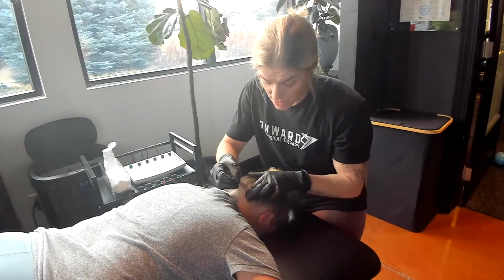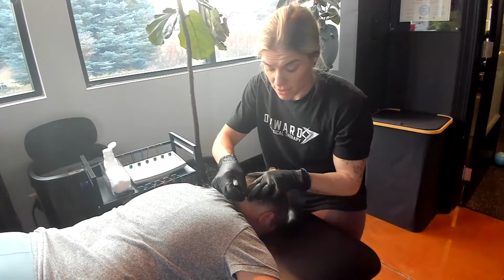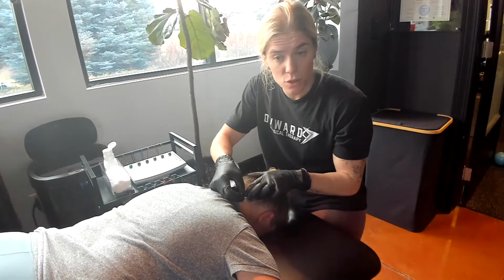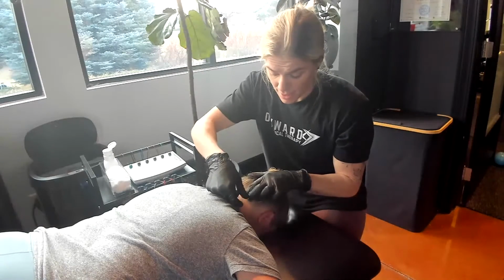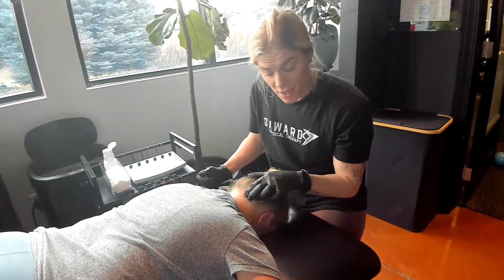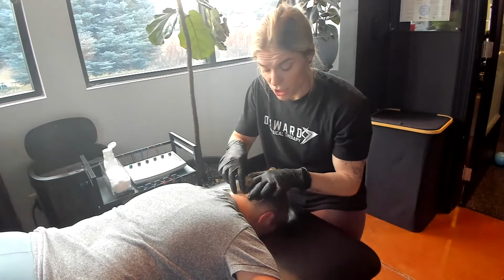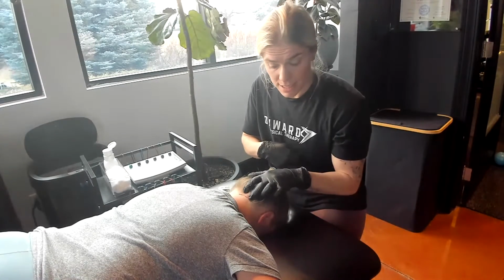So what we're going to be doing is the same sort of thing, hook, rock climber grip. Now my needle angle is a little bit more flared towards the midline, towards the opposite eyeball. Firm tap, needle towards occiput. So now we have placed both upper trap and semispinalis needle on the patient's right side.